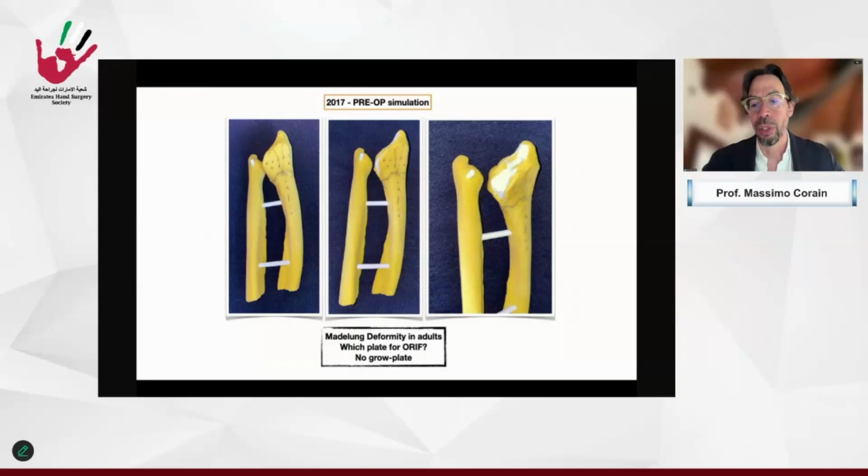These are some surgical steps of an osteotomy done freehand, a dome osteotomy, with piezo surgery. I suggest using piezo surgery in this kind of approach because it is much safer for the bone and much more precise for the cut line.